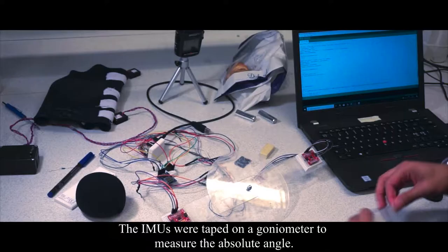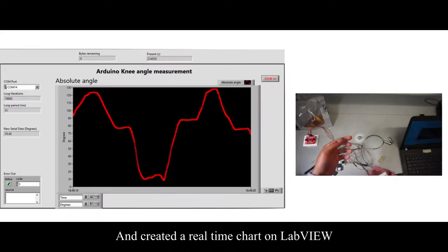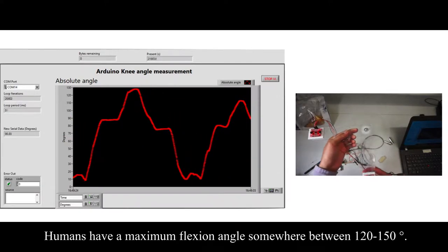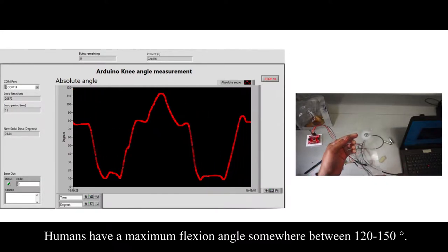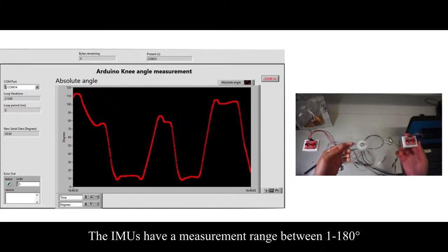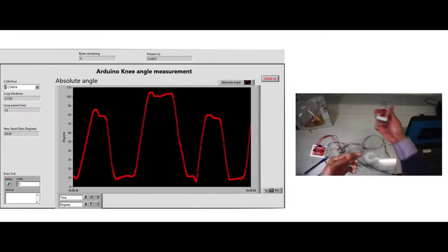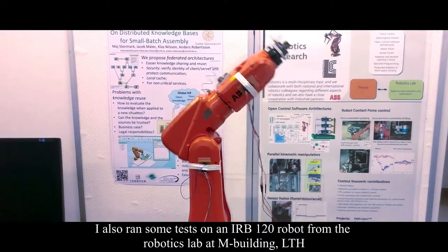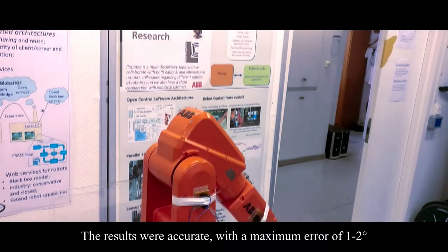To test if the angles were correct, I taped the IMUs on the goniometer and created a real-time chart using LabVIEW. Humans have a maximum flexion angle somewhere between 120 to 150 degrees and full extension around 5 to 10 degrees. IMUs can measure in a range between 1 to 180 degrees. I also ran some tests on an IRB 120 robot from the robotics lab at LTH and got very accurate results.